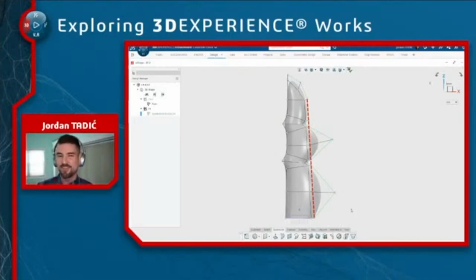Now, this is kind of a funky looking made-up scenario, but just to point something else out. And this isn't the best example that I chose here because we're doing this from the side view. If you're working from an orthogonal view, like the side, front, or top planes, then just use align by line in this scenario. But when you're working at a weird angle and you want a series of entities to be aligned in a theoretical line connecting between the 2 points, with everything else falling within that line, then you're going to want to use this scenario that I'm showing right here.